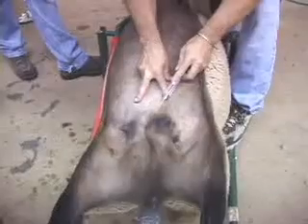The belly is then sheared entirely. Following the shearing of the belly, a betadine scrub is used to clean off all dirt and foreign materials. Wipe down completely with paper towels to remove any liquid and dry the area. An alcohol solution is used to disinfect the entire area.